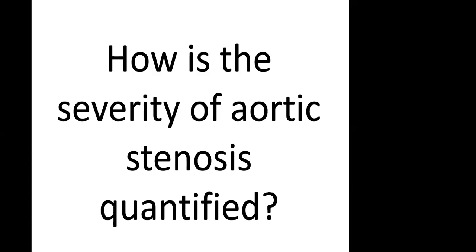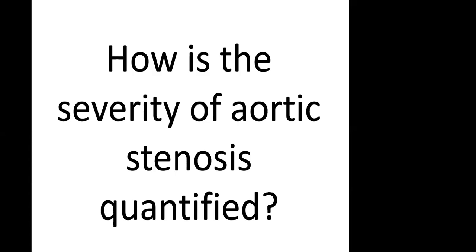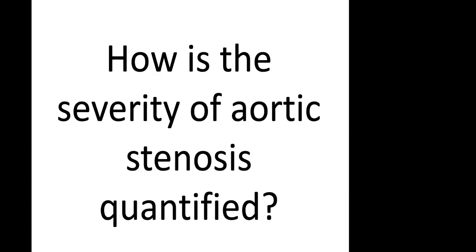You know everything. Okay, how do you quantify aortic stenosis? So the aortic stenosis, I will quantify it by means of imaging, not the history and physical examination. In imaging, the main thing is the echo. I need to see the valve area: in severe, the valve area is less than 1, and moderate is 1 to 1.5.